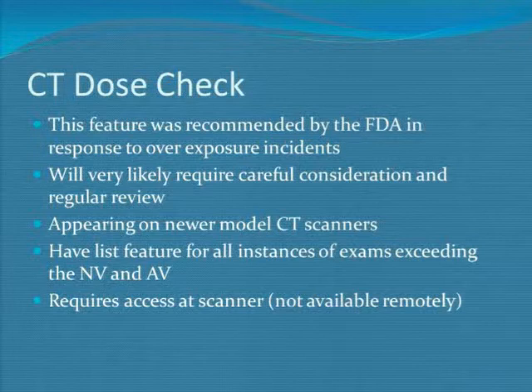There's also, what would you call it, not really a survey, an audit tool on all of these. This was another thing that the FDA, I think, asked for. So you can go in on a regular basis, maybe monthly, maybe after you get comfortable with it, quarterly, and get a list of how many times you hit the alert value, how many times the notification value was exceeded, and any more information that might have been entered about those. So you can start to look for who are the frequent flyers here? Is there one technologist that's doing this all the time? Or is it the day shift? Is it the weekend folks? You can kind of start to untangle what's happening there.